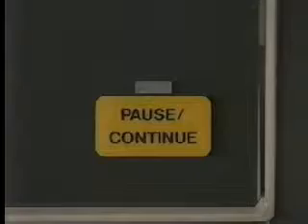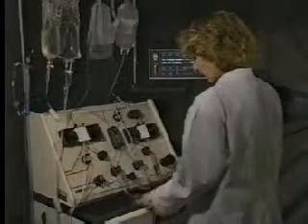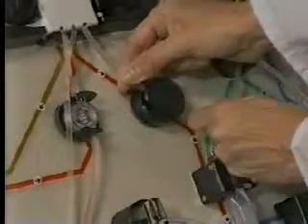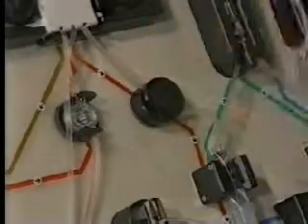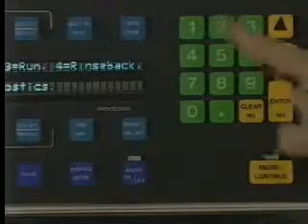If the alarm does not clear, you need to check the inlet line in the centrifuge pressure sensor. Once you move the line in the sensor, you must reprime the system. To reprime the system, press Change Mode, then select 2 for prime.